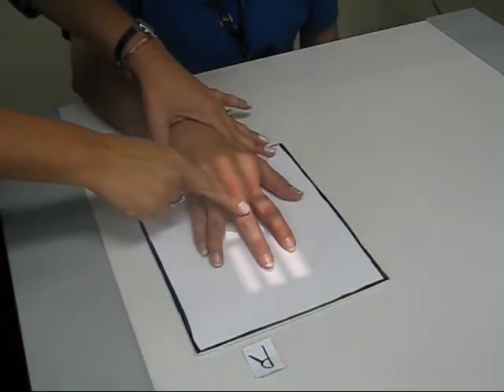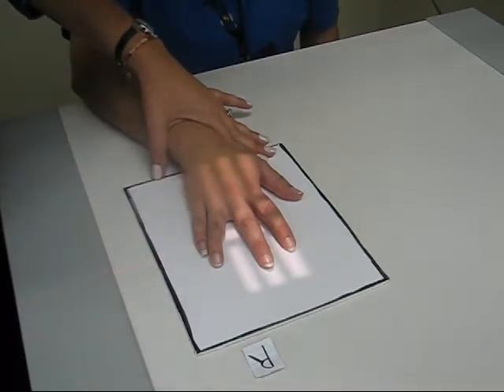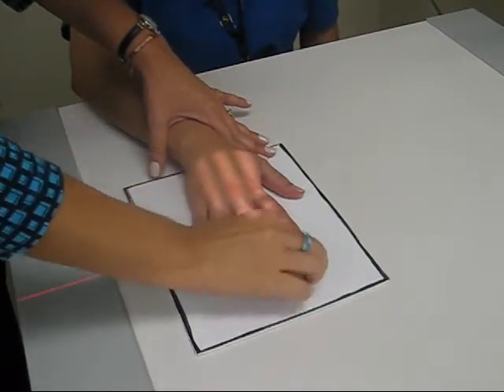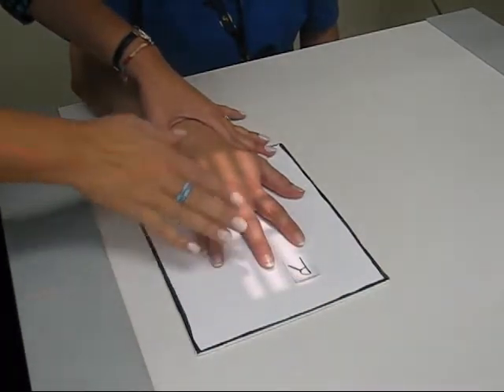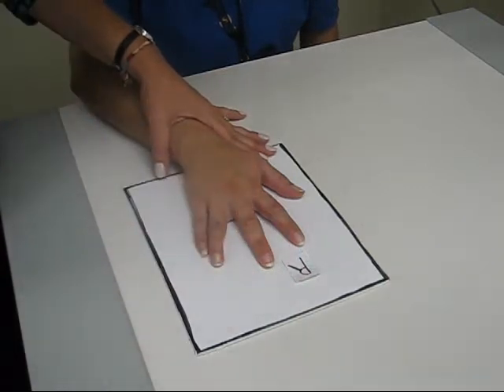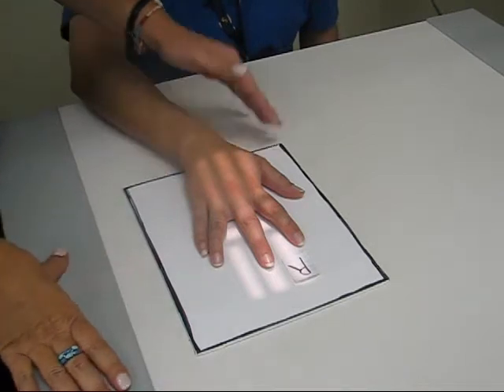You want to make sure you get the entire finger plus the metacarpal that it's attached to. You mark the side. This is the right hand. So this would be the projection for a PA of the middle finger.